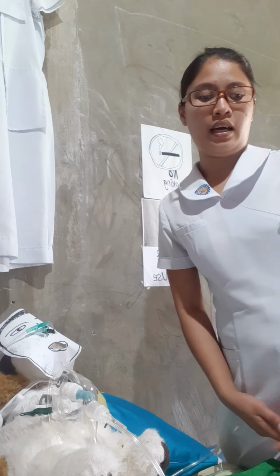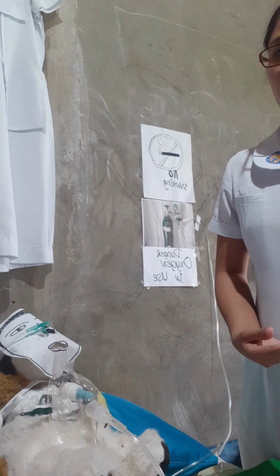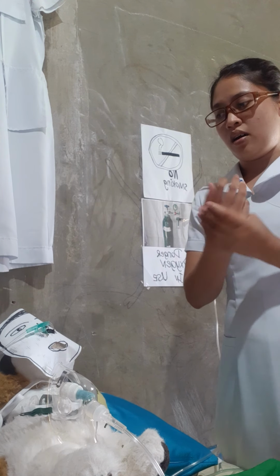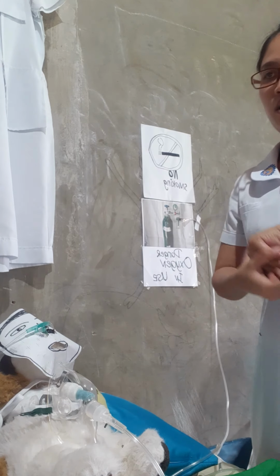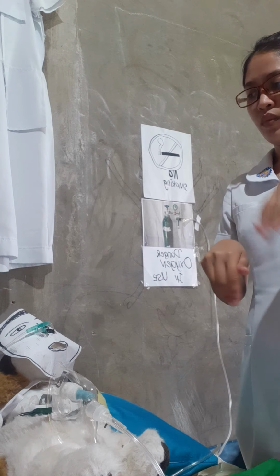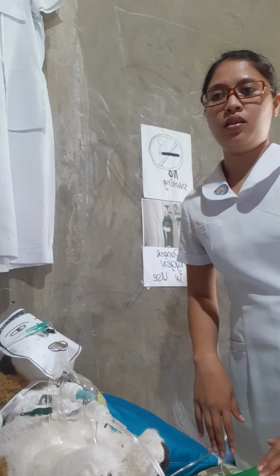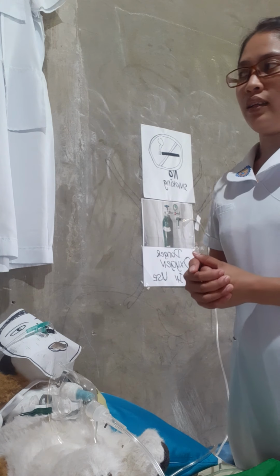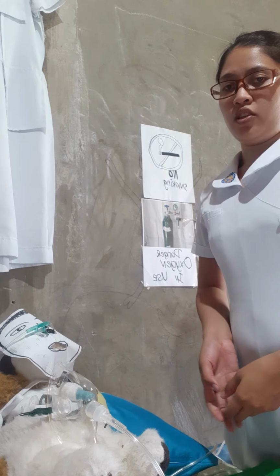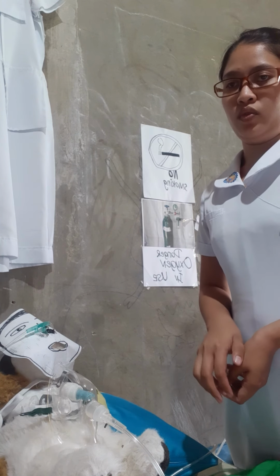Next, perform hand hygiene. After performing hand hygiene, we can adjust the bed to our comfortable working position. Then, lower side rails closer to me if applicable. Afterwards, if the client is conscious, we can place him in semi-Fowler's position. But if he is unconscious, just remain in lateral position.